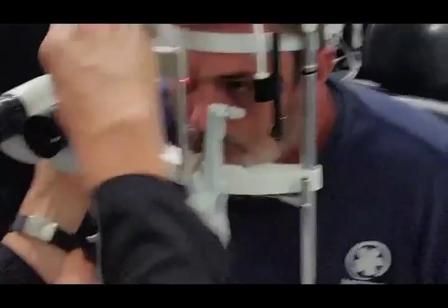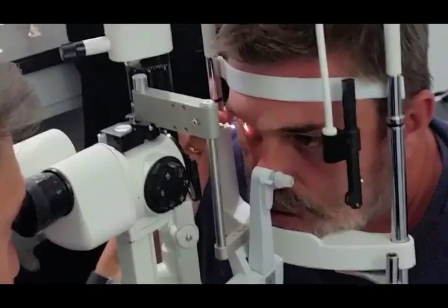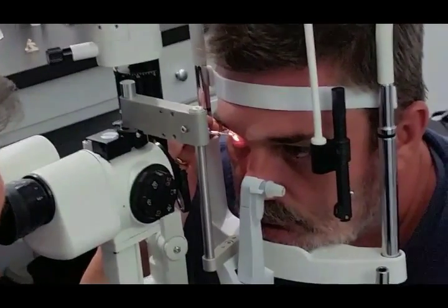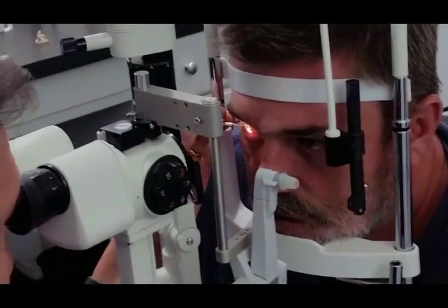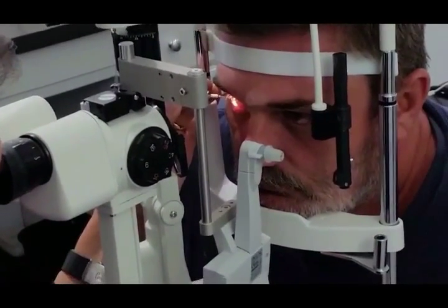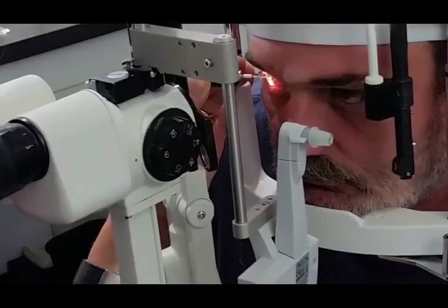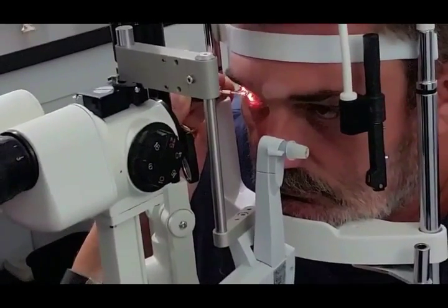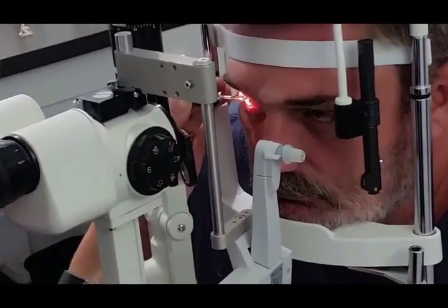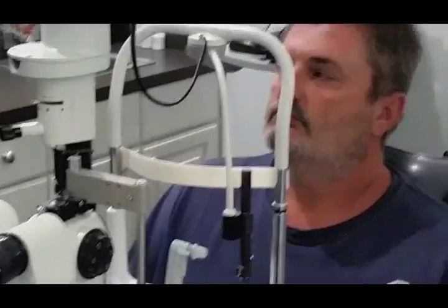Our patient today had a previous injury to the central cornea with a metallic foreign body, which was subsequently removed and left a scar at the apex of his cornea. The healing process was imperfect, so his remaining best-corrected visual acuity was 20/40. He elected, after discussing the options, to have corneal debridement with an acellular amniotic graft and bandage contact lens to try to heal his cornea in a fashion that would improve his visual acuity.